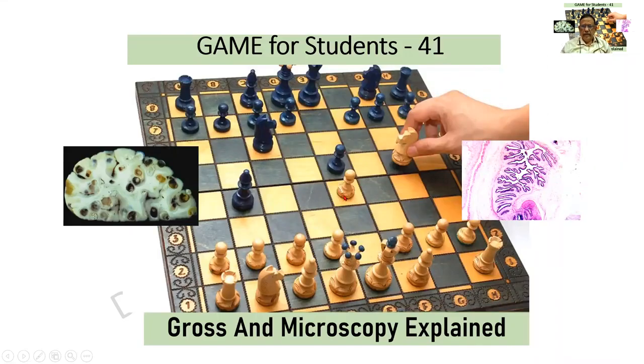Dear students, welcome to Gross and Microscopy Explained. In fact, one of the easiest of the games. This shall be exactly the structure that will be focused on for you under the microscope. And I hope you can guess what the organ on my left is.